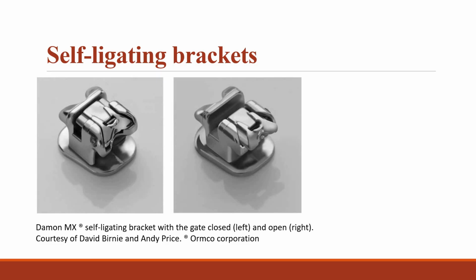The concept is not new, having been originally pioneered in the 1930s. However, these bracket systems have undergone a renaissance over the past 2 decades, largely because of enhanced ingenuity and reliability. Self-ligating brackets provide a number of theoretical advantages over conventional appliances, because they reduce friction: more robust ligation, more efficient tooth movement and sliding mechanics, enhanced rotation control, and reduced chairside adjustment time.